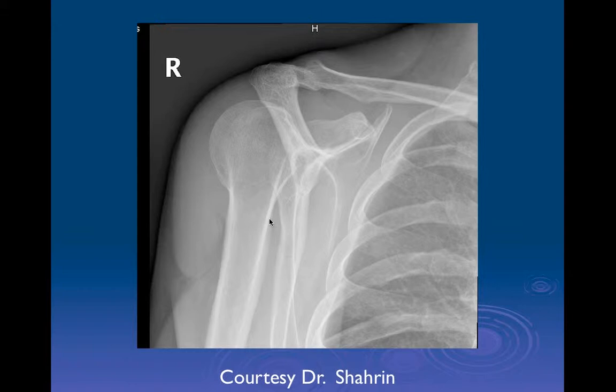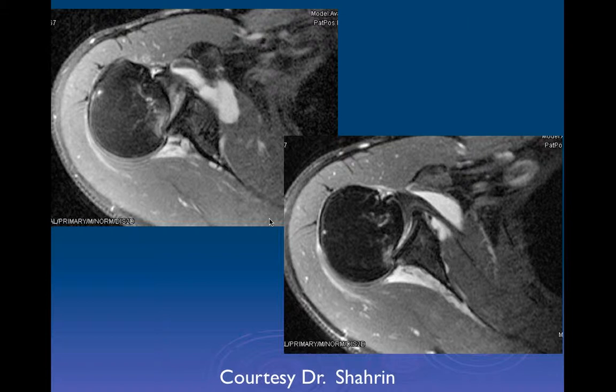Yeah, that's very good. As you probably know, historically, this is an extremely common cause of malpractice suits, missing posterior dislocations. And on the AP view, especially if it's angled properly, which this is close but not perfect, you should not have overlapping of the humeral head with the glenoid. That suggests that the patient may have a posterior dislocation. And you can also see that this is very much internally rotated there with a little groove here. And then if we go to the Y view, which is the reason why we really like to do multiple views in the shoulder, you can see the dislocation there.